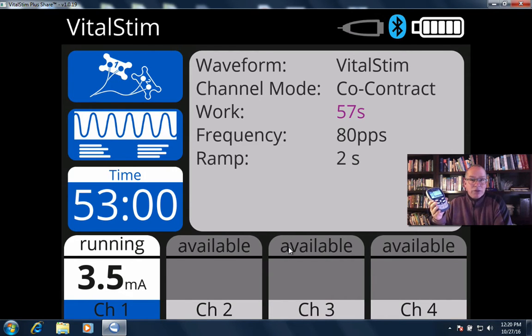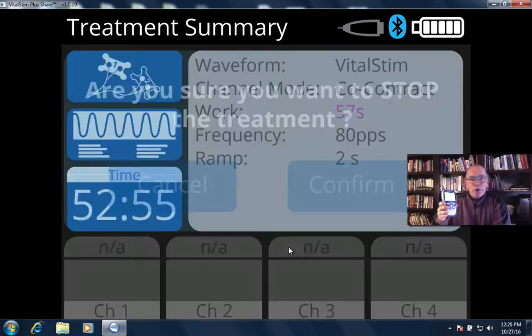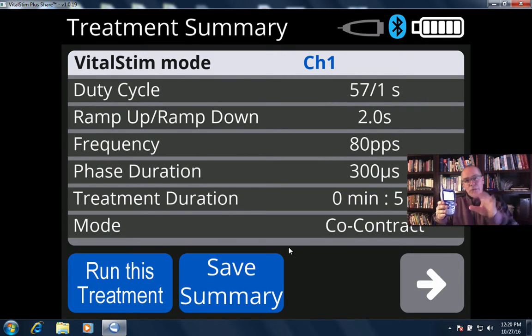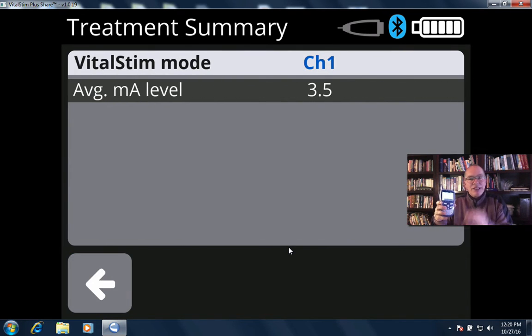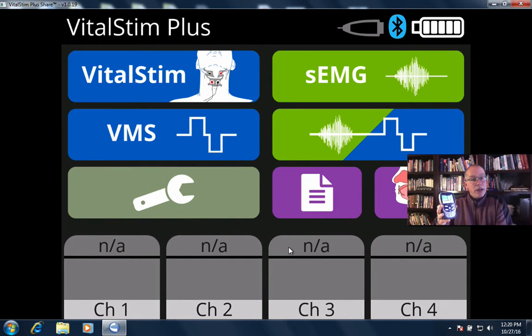That's it — that's VitalStim therapy, nothing to it. Once the treatment is done, either it stops by itself when the time runs out, or I press stop and confirm. Then I get a summary screen. The therapist can use this summary screen to jot down details like exactly how long the stimulation occurred and what the average intensity was used.